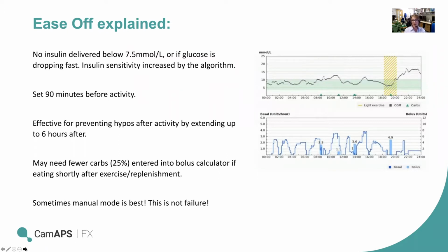And some people may find that if they're doing a very adrenaline fueled, intense exercise, they may not need to put that on. They may find that actually the algorithm helps deal with the high blood sugar as they're doing the session. But for the majority of people, we tend to say you're likely to see a drop in any kind of habitual sport or activity that you're doing.